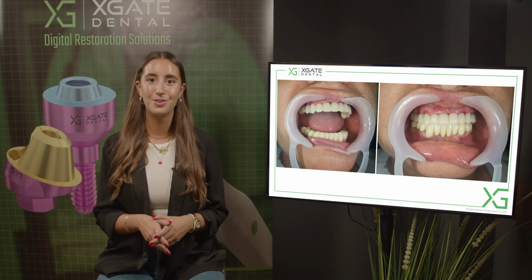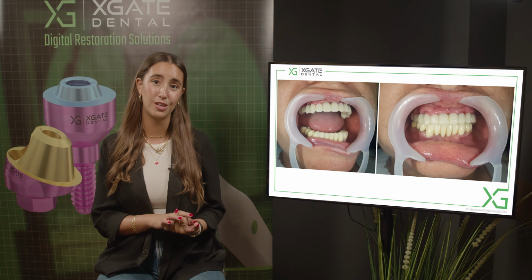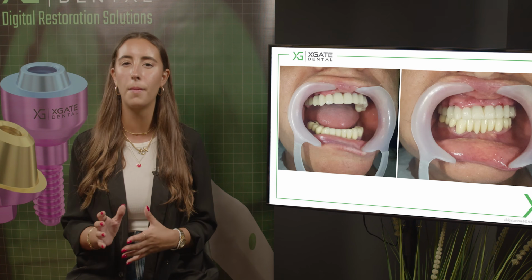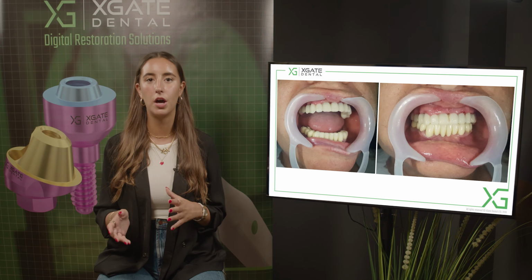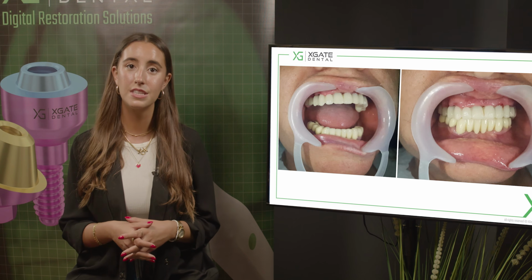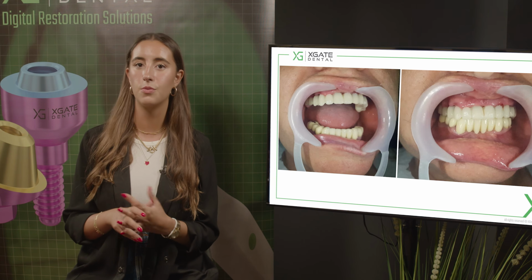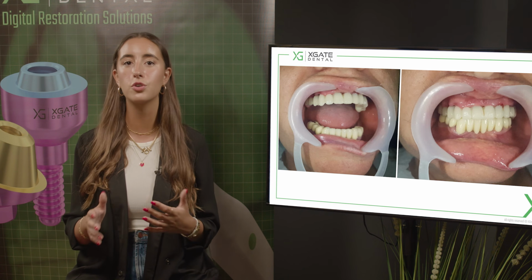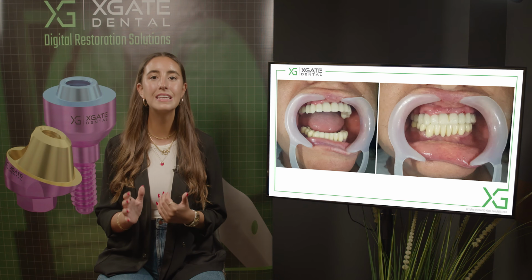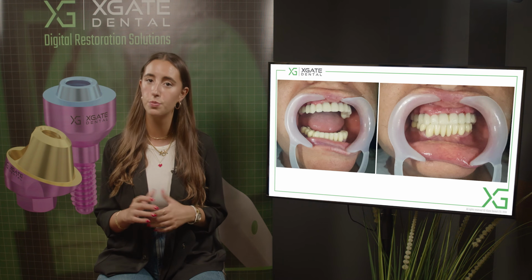This is the bridge. You can see that the picture was taken after it took some time to heal, and you can see that the gingival color is somewhat better. You don't see all of the blood and the inflammation that was there before because of the surgery. You can see that the relations are the same as they were before, and this was taken about a week or so after the operation. You can still see that there's no complete healing of the gingiva, but everything is much better.